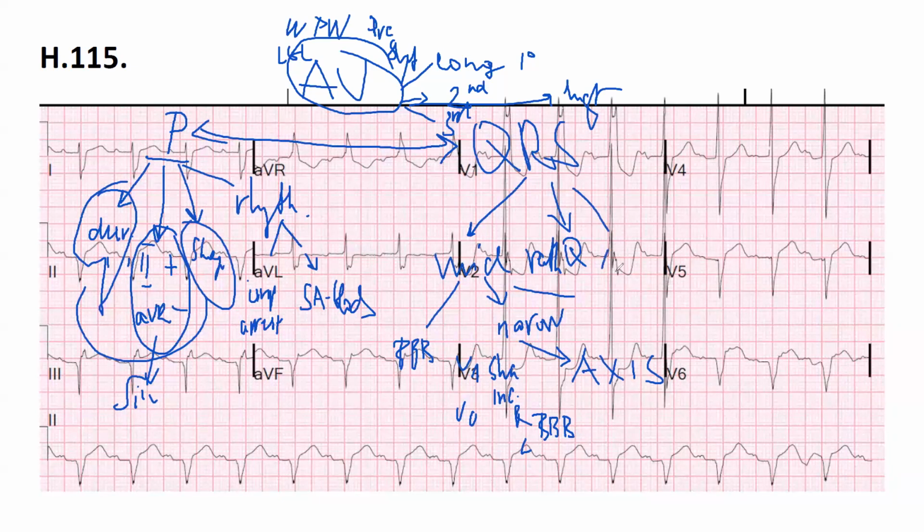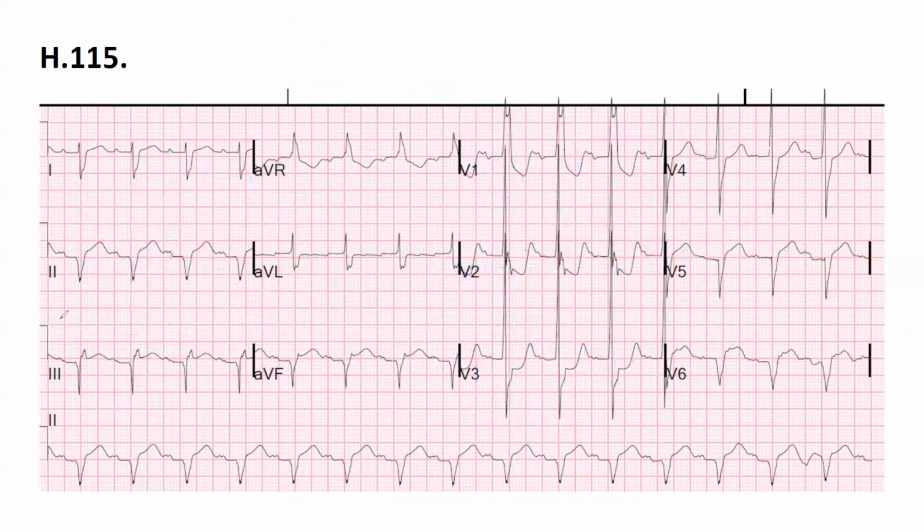And the axis, I would say the axis here, okay, axis. If it's abnormal, this is an extreme right deviation or extreme left deviation. If you have an extreme left deviation, that means left anterior hemiblock, unless you do have all those things that I mentioned, or left posterior hemiblock. Okay, and after that you can go for the ST segment. Now this is how you go through all ECGs, step by step. This is important. All right, now.